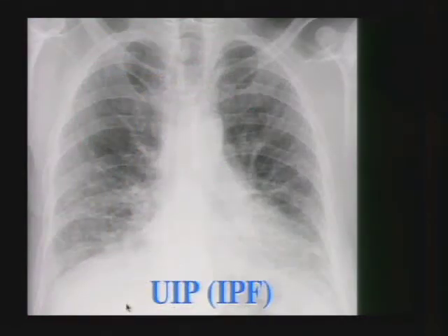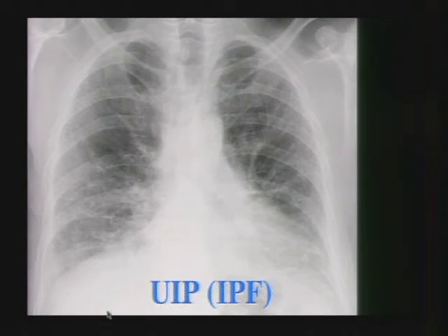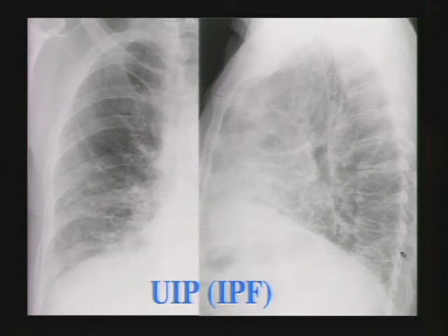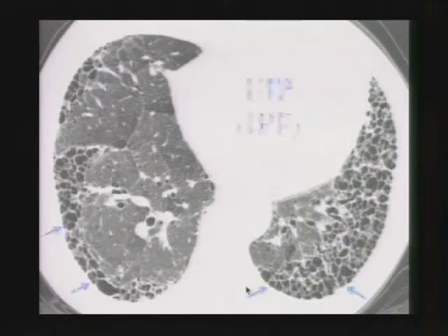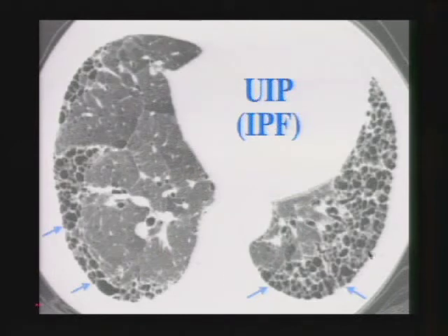On chest radiograph, UIP-IPF shows reduced lung volumes because of fibrosis and lung restriction, with a reticular abnormality at the lung bases. On a lateral view, the earliest and most typical finding is a reticular pattern in the posterior costophrenic angle. On high-resolution CT, we see honeycombing in a subpleural location — black holes immediately beneath the pleural surface. This person has moderate to severe honeycombing with multiple layers, and the distribution is subpleural, posterior, and lower lobe predominant.